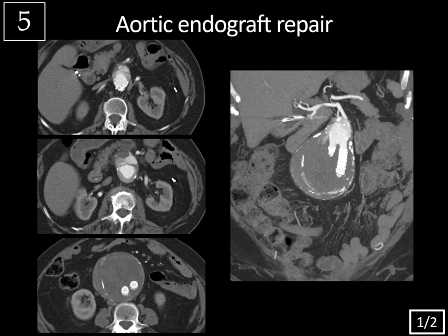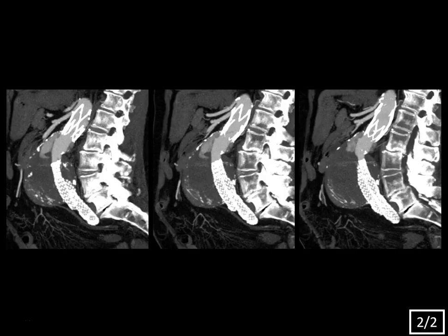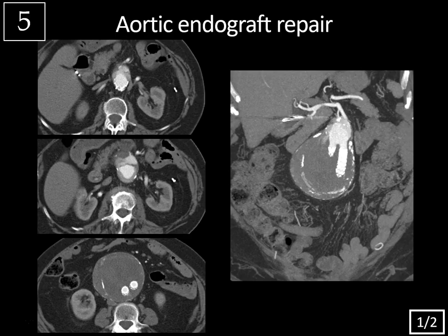Last case, history of aortic endograft repair, CT angiographic images. This was an ovation endograft. So here we're looking at axial images on the left-hand side, and you can see that there's a large abdominal aortic aneurysm here, infrarenal, and then there are the iliac limbs of the stent graft. You don't see any endoleak at this level — just non-opacified aneurysm sac. But at the superior aspect of the endograft, you do see this contrast pooling anteriorly. Whenever you see contrast at the superior aspect of an endograft, you worry about a type 1a endoleak.